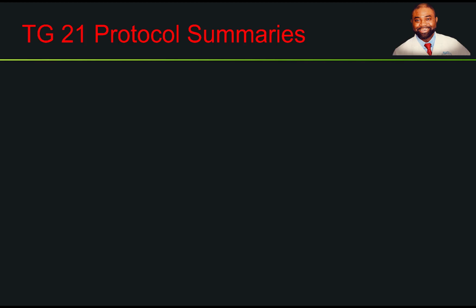You have the N gas, which is the cavity gas calibration factor. The product of N gas and the corrected meter reading gives us the dose measured in the gas, taking into consideration all the correction factors.